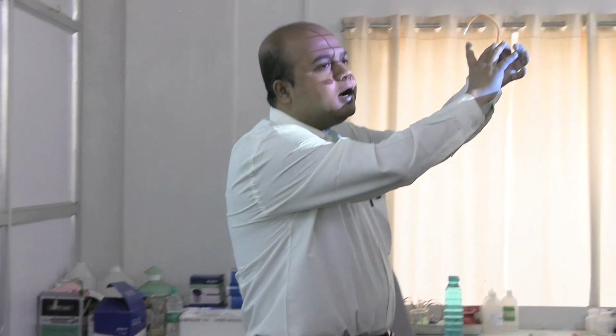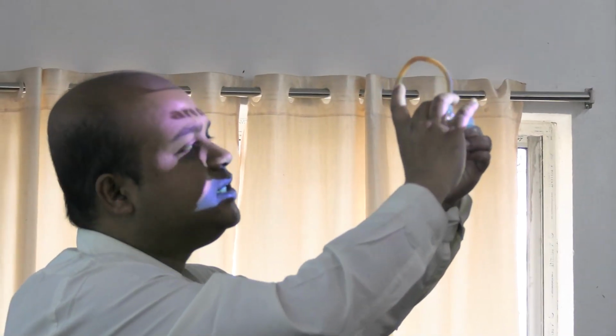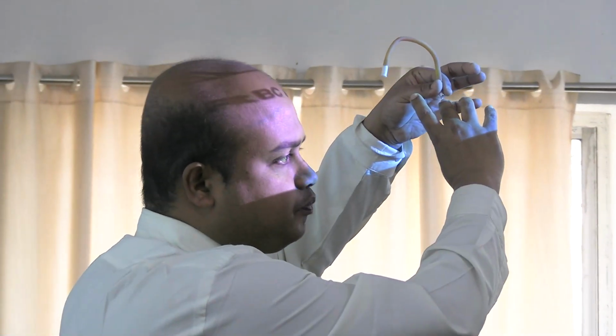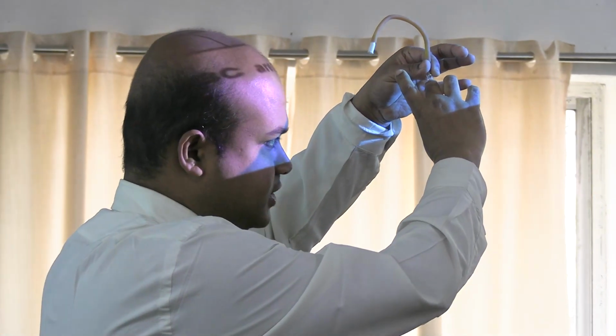So this has to be discarded very carefully, so that the diluted blood does not go out. So this is discarded and then the rest is charged within the Neubauer chamber. That is why we are calling it 20 times diluted, because the whole blood and fluid mixture is 11 minus 1. This 1 does not contain any blood cells.